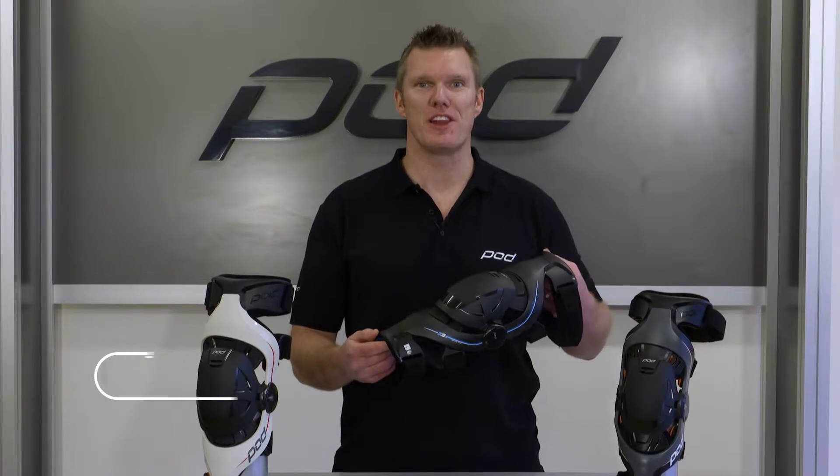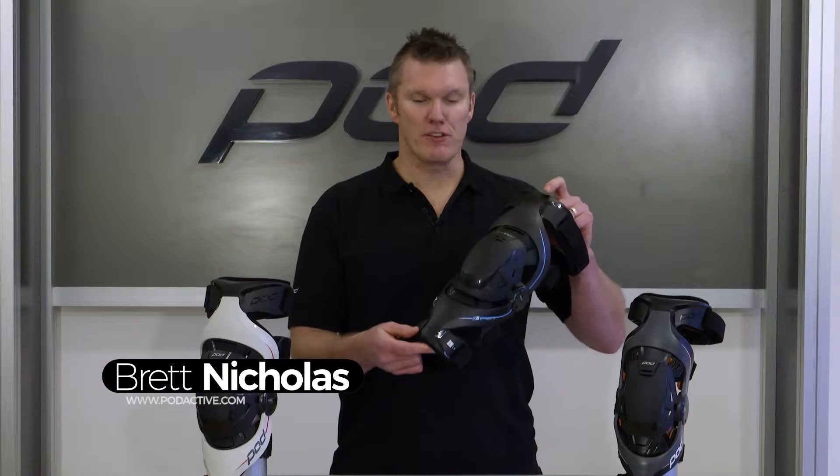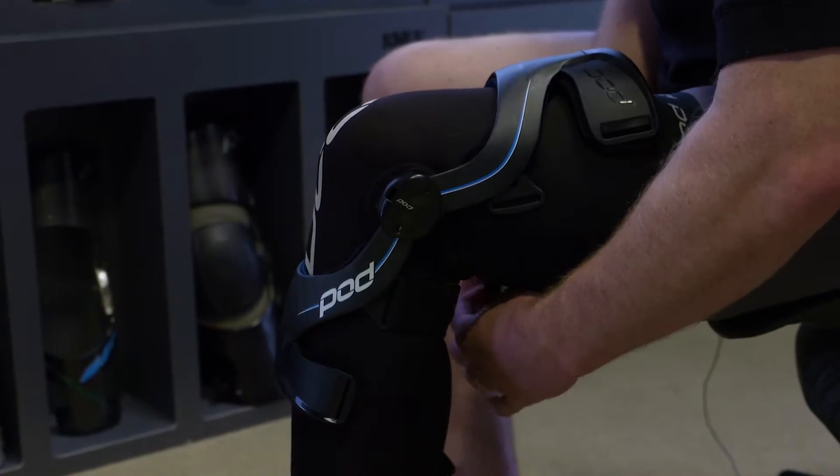Hi, I'm Brett from PodActive. In this video, we'll be removing the Patella Cup and the impact protectors to convert your K-series brace into a multi-sport brace.